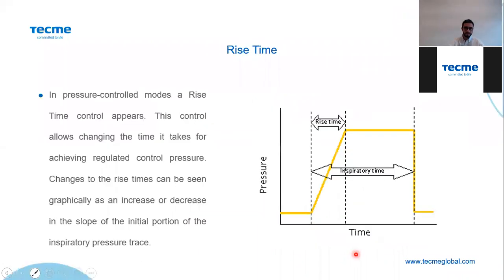Another parameter which is introduced in pressure control mode is the rise time.